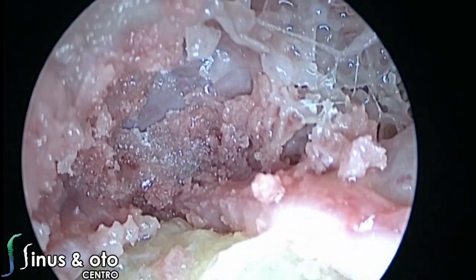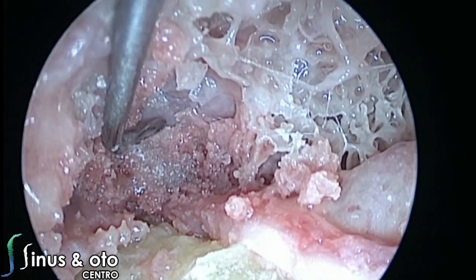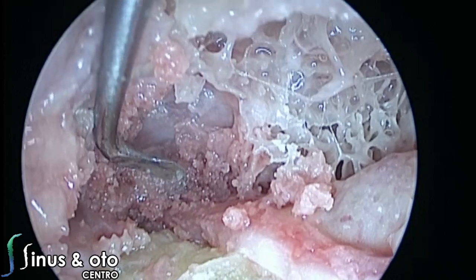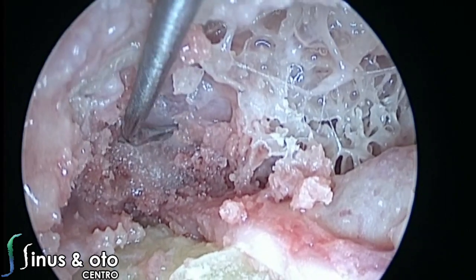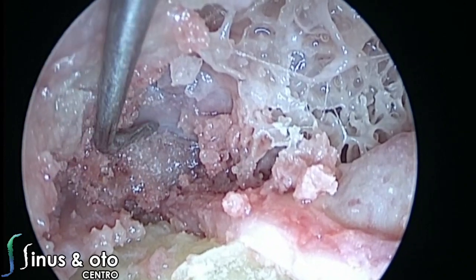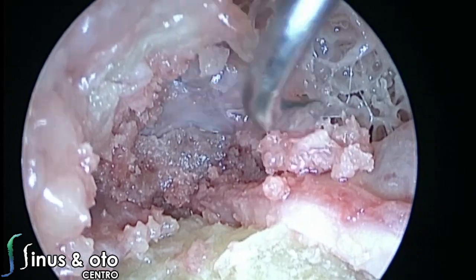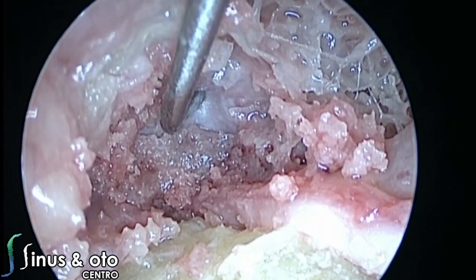So you see the middle fossa dura, and you see that it descends towards the eustachian tube and towards the geniculate ganglion. And of course, this is a region with a very close relationship between the geniculate ganglion, the eustachian tube, the tensor tympani muscle, and the middle fossa dura.